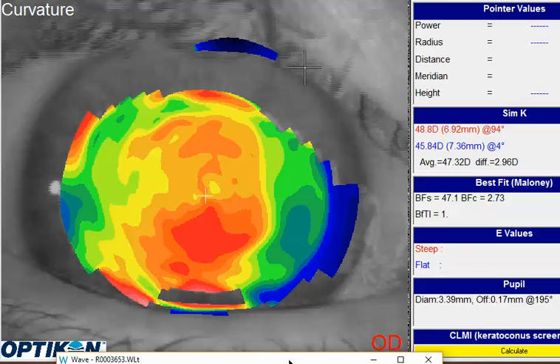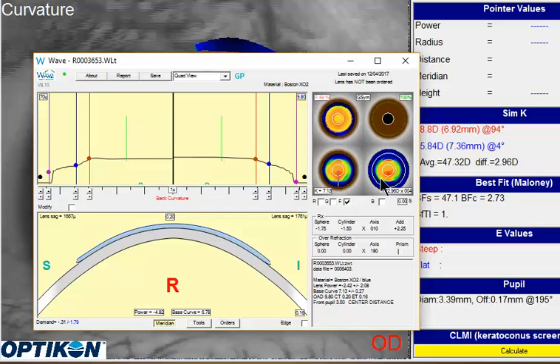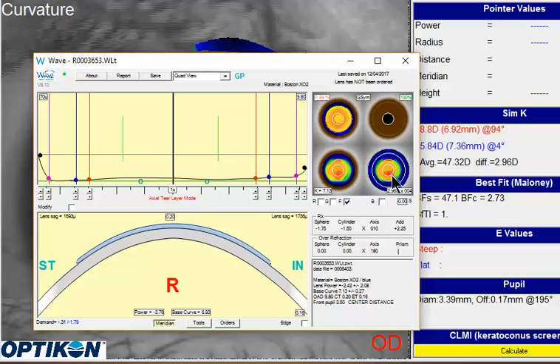With that said, your design actually looks quite nice. Keep in mind, since this is a freeform design, most of these Wave lenses will have a tendency to match the cornea very closely and therefore have a tendency to hug. Sometimes in these corneas, you might get a little extra rubbing in these lenses. Compared to the patient's prior lens, I guess the other lens was probably not a free-form back surface lens, so therefore it probably had a little more tear exchange, a little more edge lift on it.